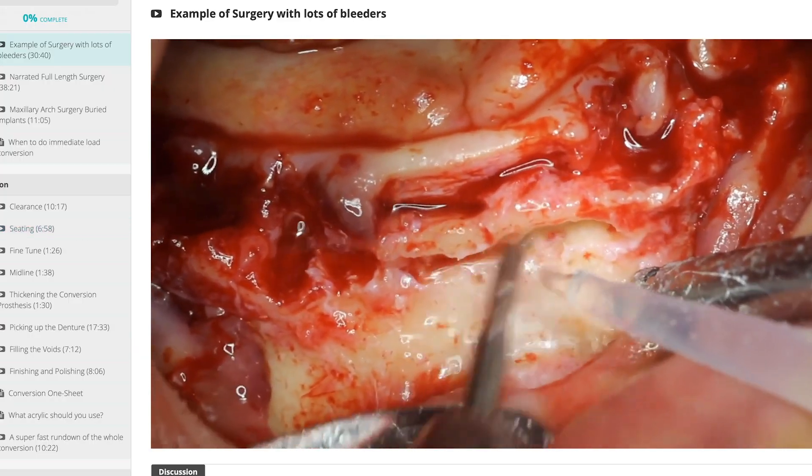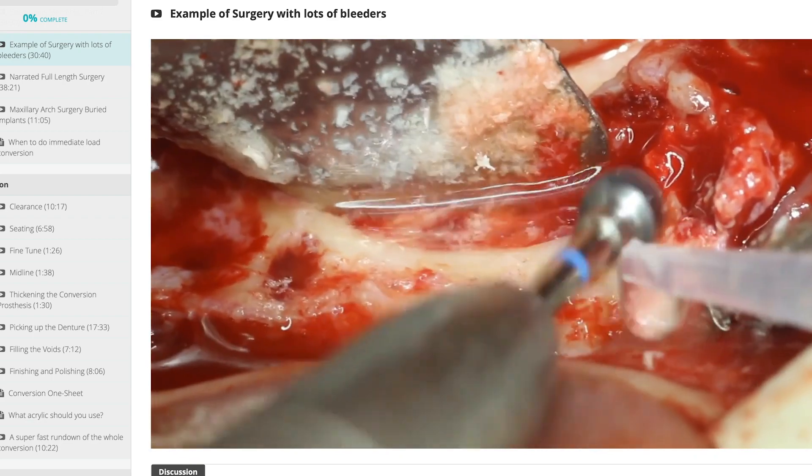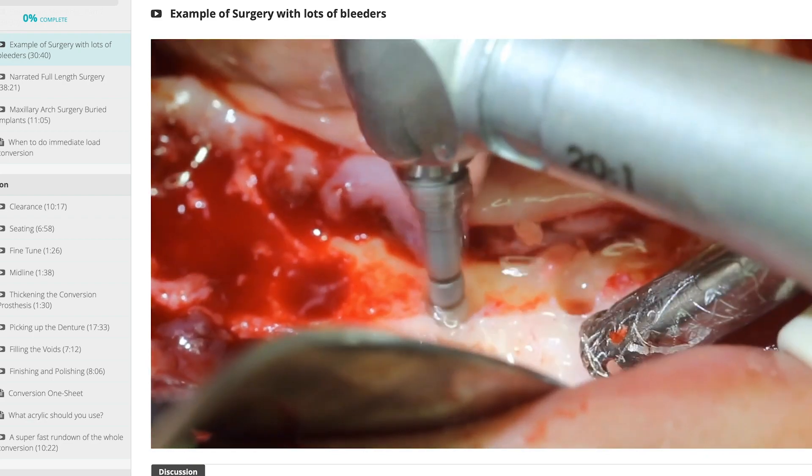I'm going to show you some tips on how to get your implants all lined up well, and a bunch of other tricks to getting your surgery done predictably.